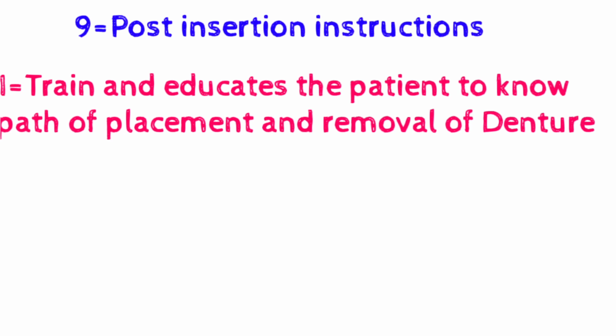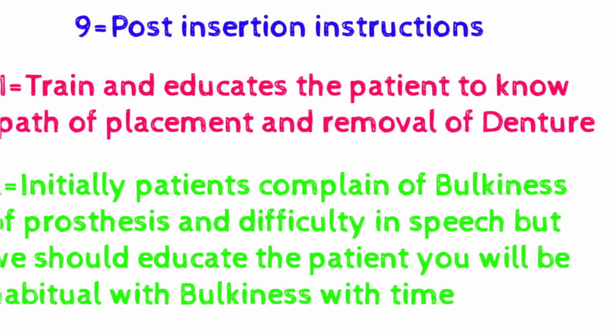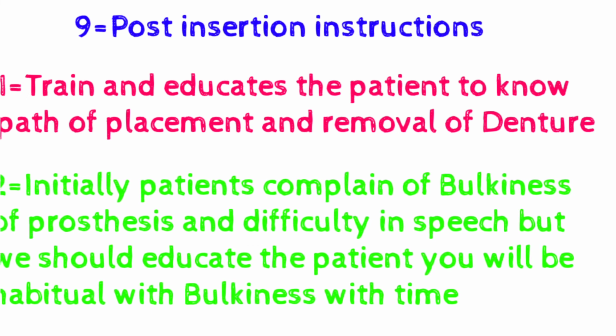Number 2, initially the patient complains of bulkiness of the prosthesis and difficulty in speech, but we should educate the patient: you will become habituated to the bulkiness with time. When you use it, you will be habituated. There will be no problem for you.